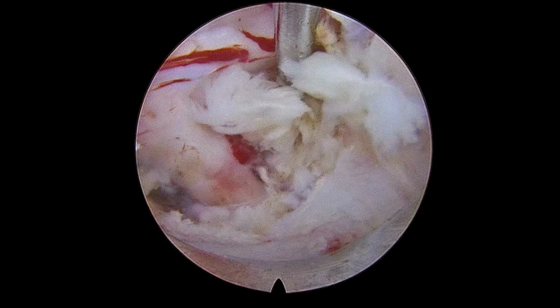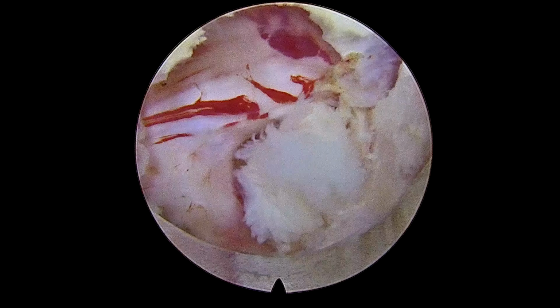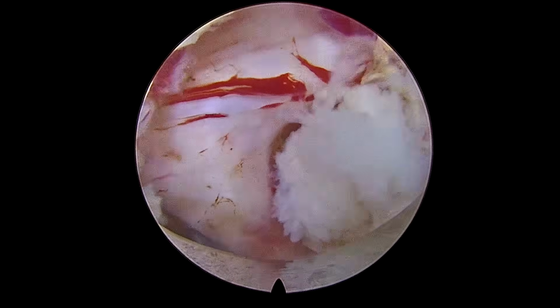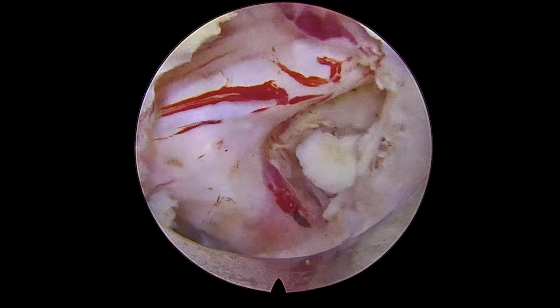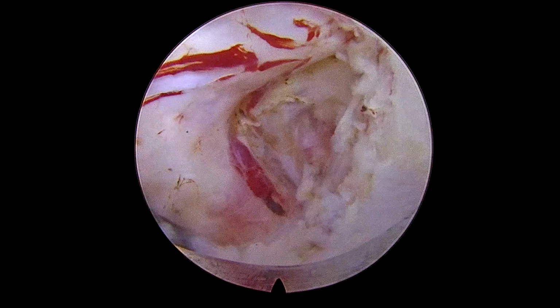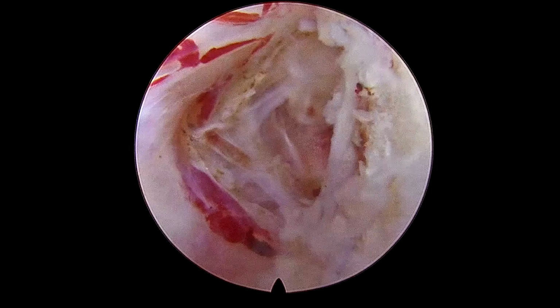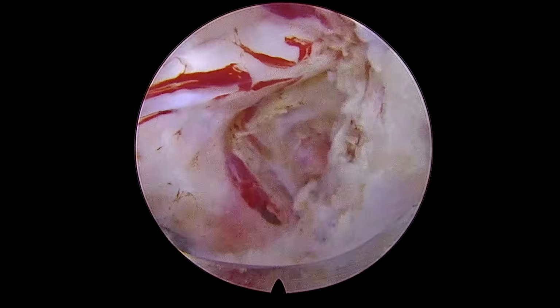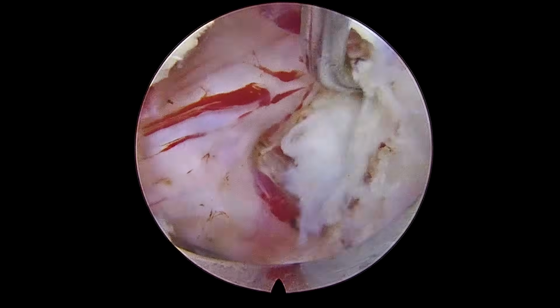The procedure is more like the lumbar discectomy, but in the cervical area you have to be very cautious. You are not allowed to retract the root or the cord. So use instruments like a hook which can go under the dura or under the root and then extract the fragment from that place. Two or three loose fragments are already out. One more.